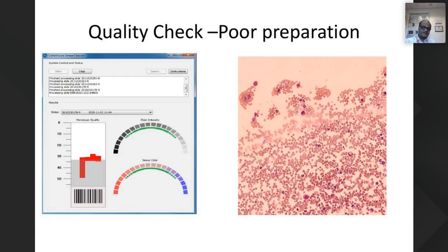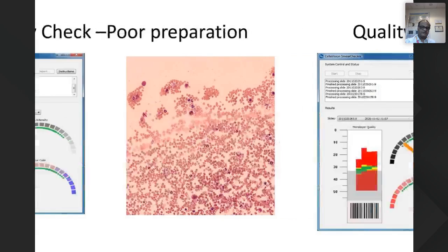One of the prerequisites for digital morphometry is an automated smear maker and stainer. If we don't have an automated smear maker and stainer, your digital morphometry will not be of use. Please understand this. When you are going to convince the management, you have to convince them in such a way that you get the green signal for the automatic smear preparation, stainer, as well as the digital morphometry itself. Otherwise, it will be difficult for you to get a good quality output from the digital morphometric machines.